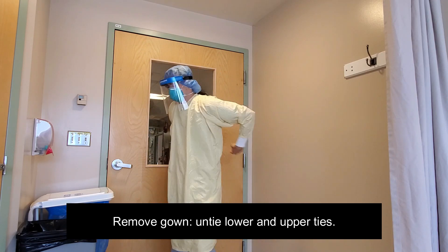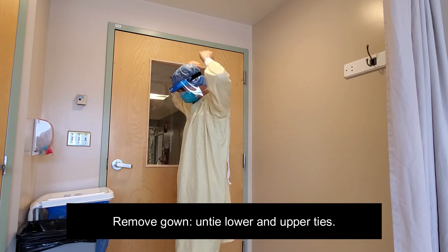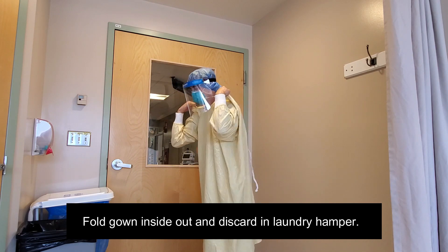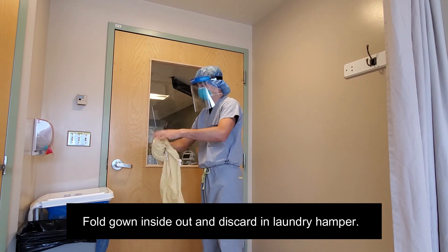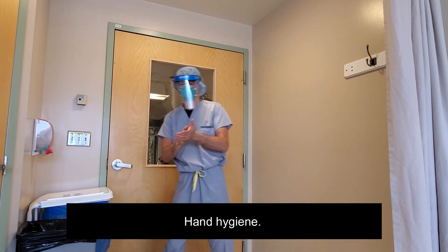Remove the gown by untying the lower and upper ties. Grasp the back of the gown, lean slightly forward, and roll the gown away from the body. Fold it inside out and place it in the provided laundry hampers. Perform hand hygiene.